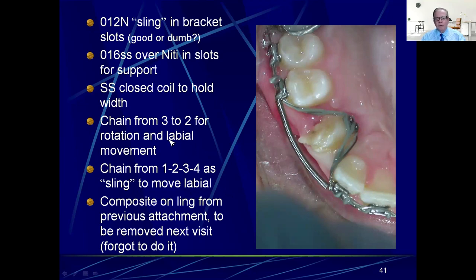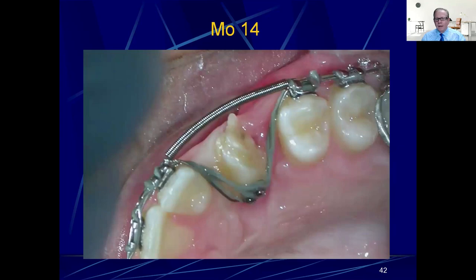There's a chain from the three to the two for rotation and labial movement, and then a chain from one-two-three to four like a slingshot again to shoot this thing out into the arch. I forgot to remove the blob of composite because I was so interested in getting the thing rotated and spun. That actually proved to be a good thing — the patient came back early because that sharp edge was irritating her lip as the tooth moved and started poking into it, so we got to change the chain. Chain only lasts about two weeks before it runs out of energy.